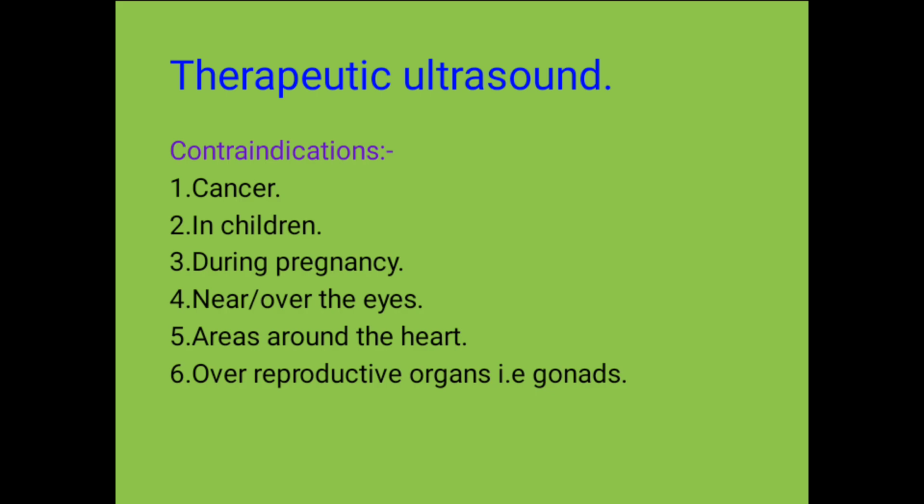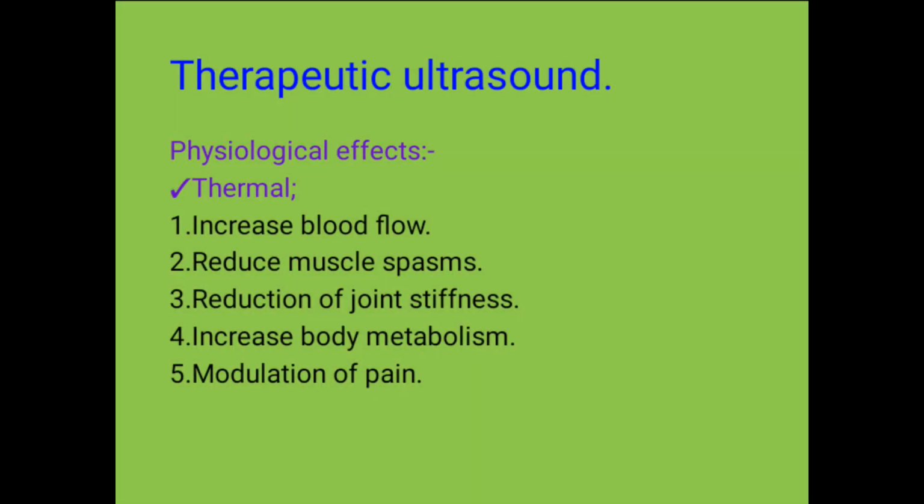This is because they are so sensitive and it can even damage them. So imagine a case where you are controlling a certain condition or in rehabilitation, and then your gonads are damaged. You do not have the ability to do something good. So it should be contraindicated for that.